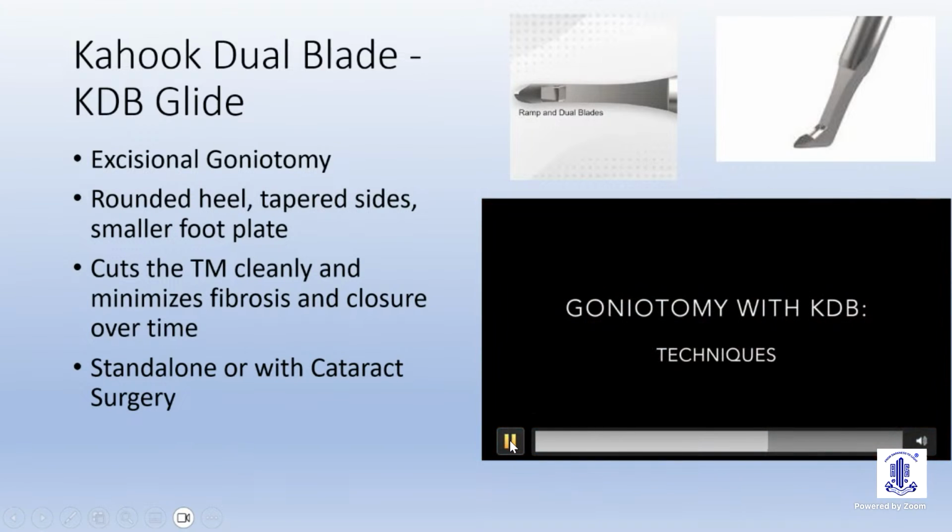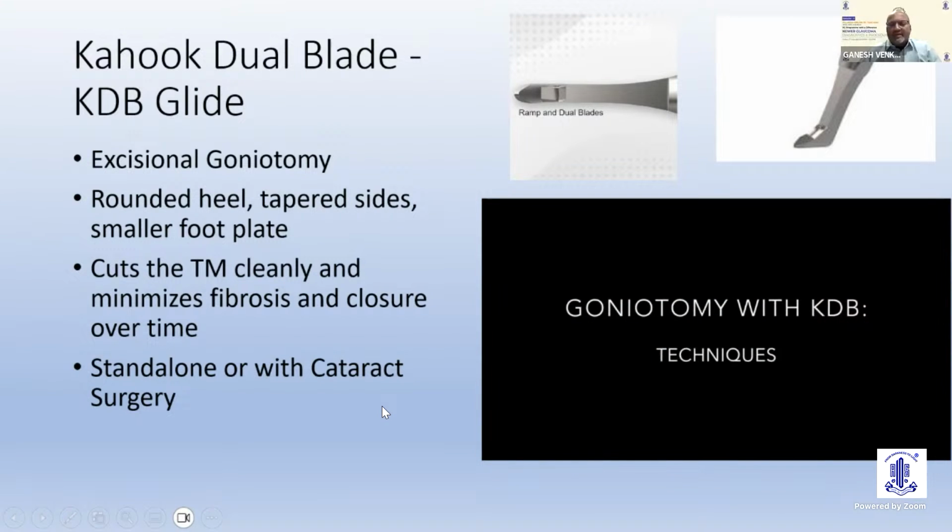I'd like to go over 3 techniques. So as shown in the video, it cuts the trabecular meshwork very cleanly and minimizes fibrosis and closure over time. And you can do it standalone or with cataract surgery.